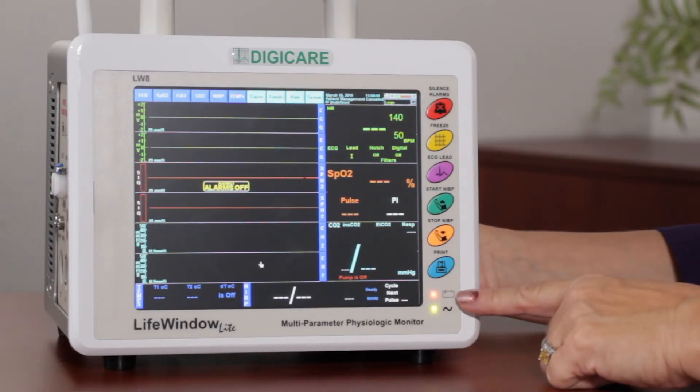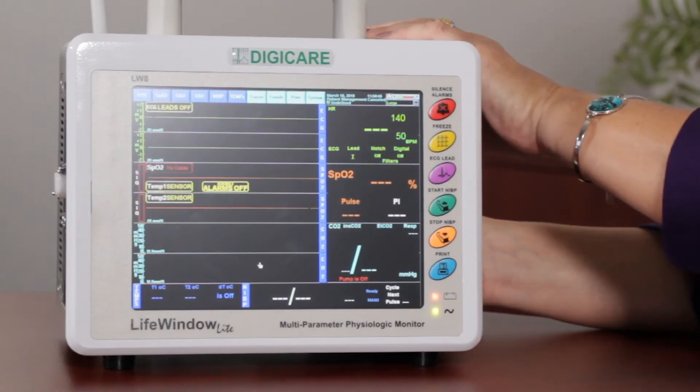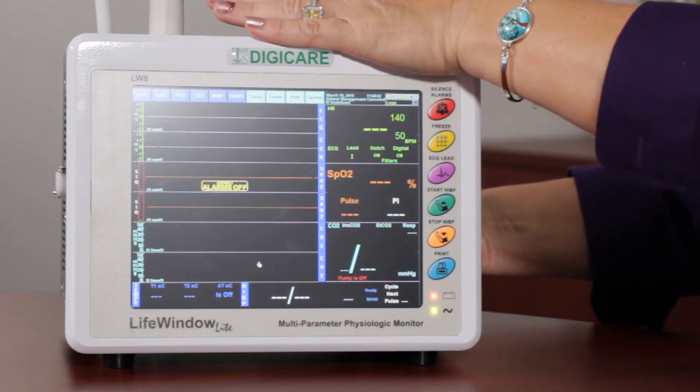On the bottom, we have two LED lights. The top one is for the battery, and the bottom is for your power supply. You can see if I disconnect the power supply here, this light does go off. So you want to make sure that your monitor is plugged in at all times.